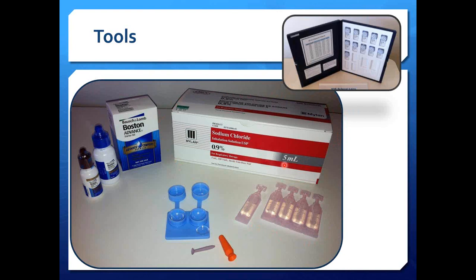We also use both DMVs. The large DMV for insertion creates a very stable platform to insert the lens. We'll cut off the tip and take away the suction because we really don't use this for removal. It's used only for insertion, and just by placing the lens in the cup here, it'll be very stable. You don't need any suction force.